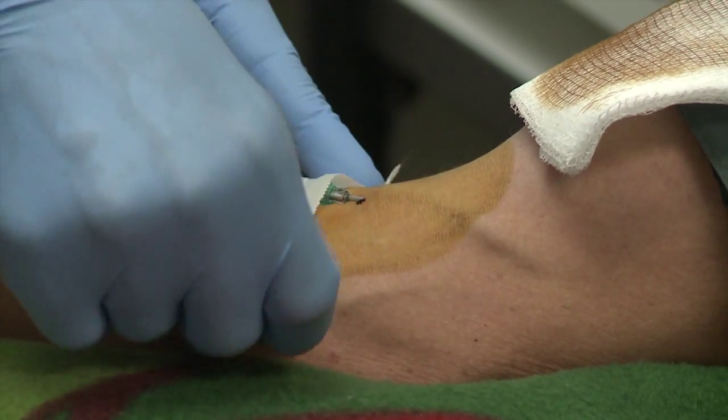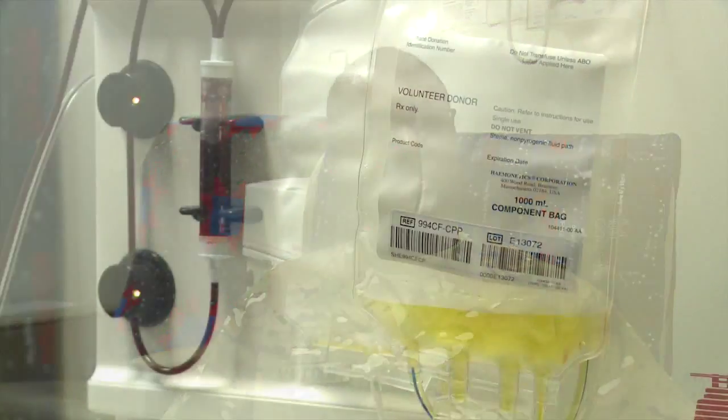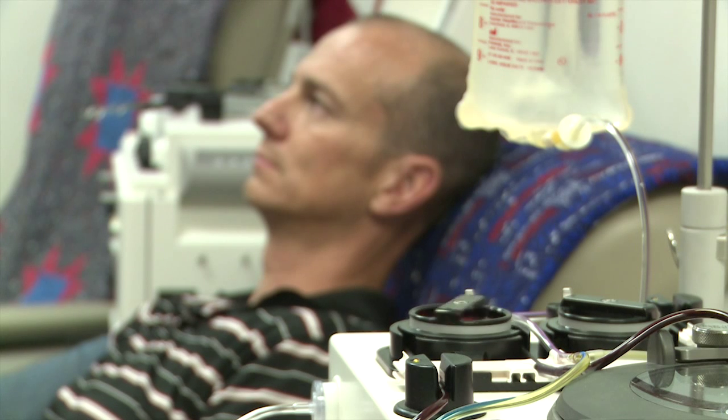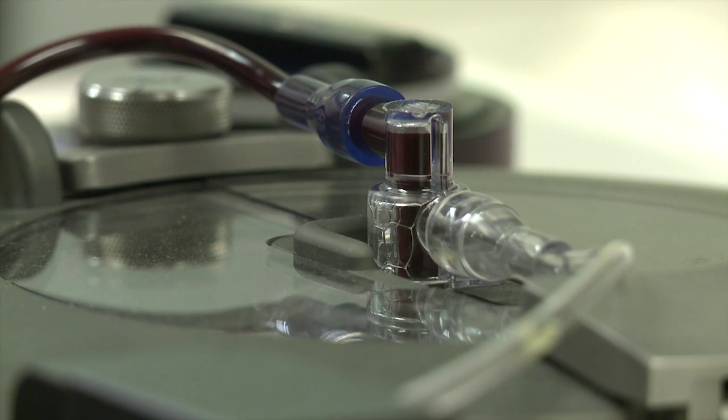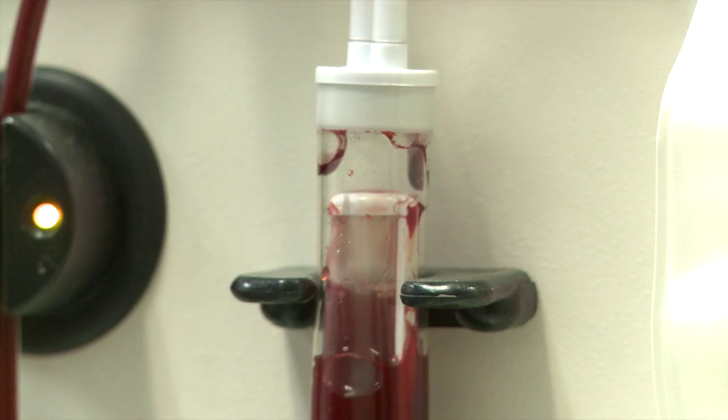The machine extracts some blood from you and it separates it into red blood cells, platelets, and plasma. It keeps the platelets, it sends back the red blood cells and the plasma. And when it returns, that's one cycle. It does this in a number of cycles. The reason it does it in cycles is so that it doesn't take too much blood from you at once. Another advantage to the machine taking only a little blood at a time is that you will not experience any weak feeling many donors get when they donate whole blood.